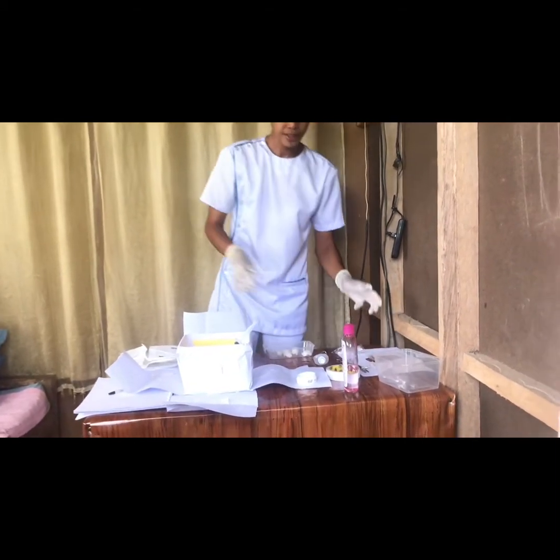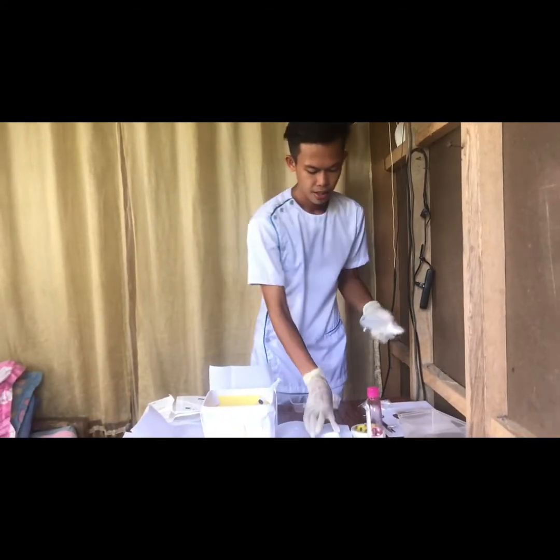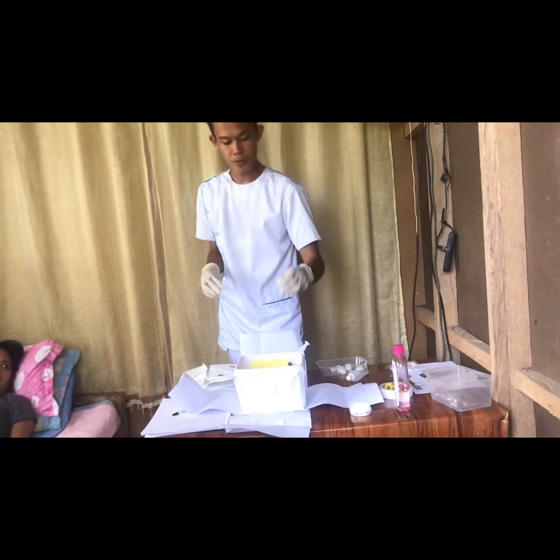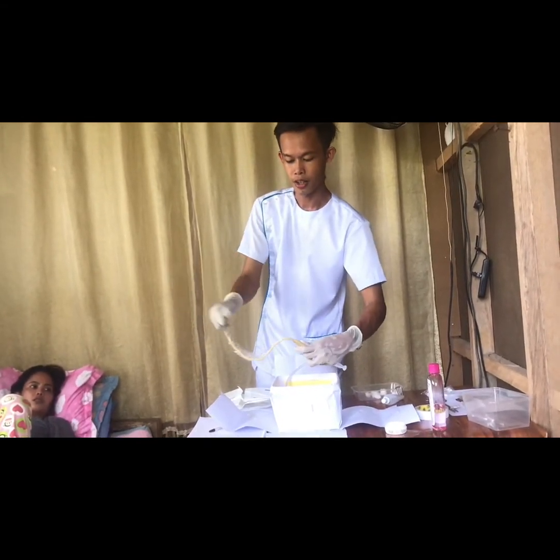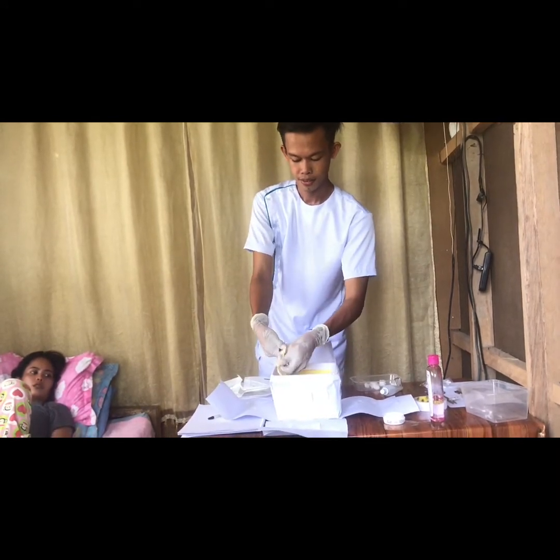Okay, so in the meantime, we are now going to spray a little amount of the lubrication into this lubrication cup. Okay, so this time, I'm going to take the catheter size 16, and I'm going to remove the wrapper of the size 16 catheter.